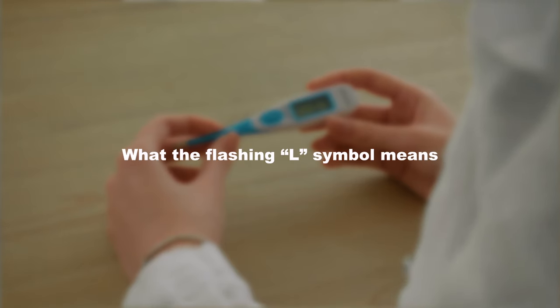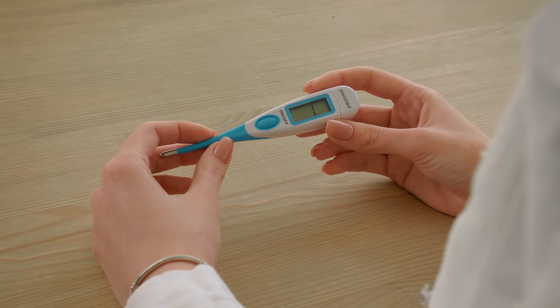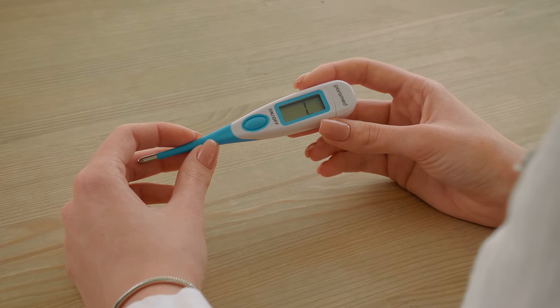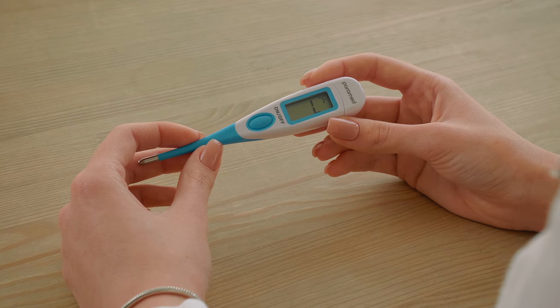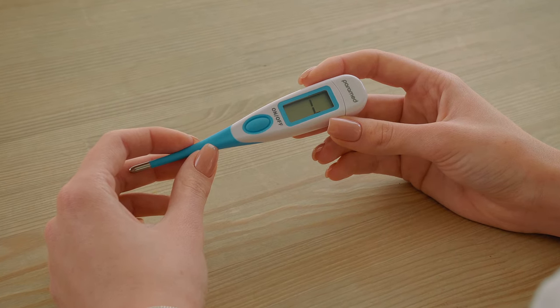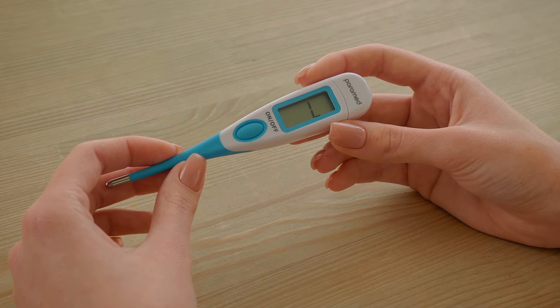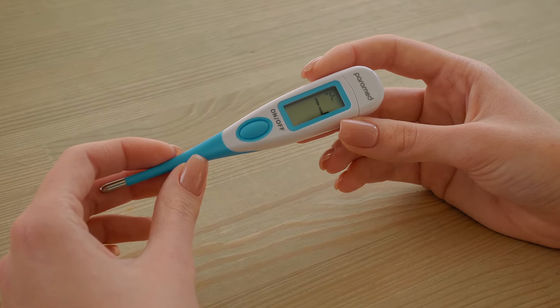What the flashing L symbol means. It means that the air temperature is not high enough for the thermometer reading — that is, it is below 32 degrees Celsius. This is not a low battery warning. It is just a sign to place the thermometer in a location where it will be able to measure the body temperature.